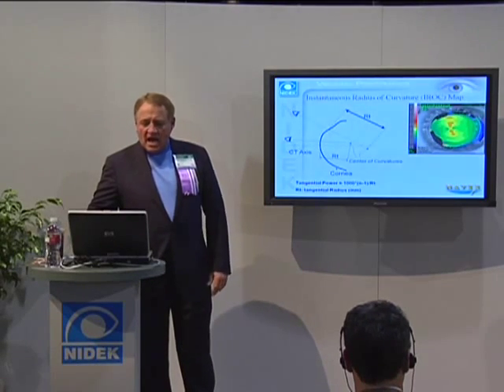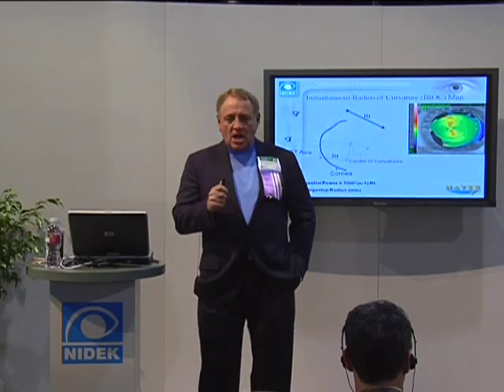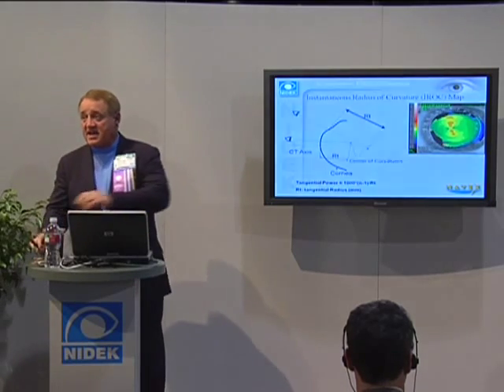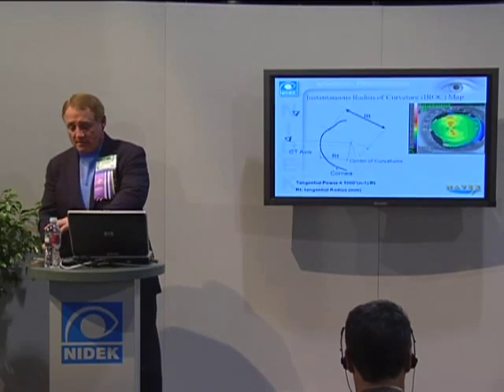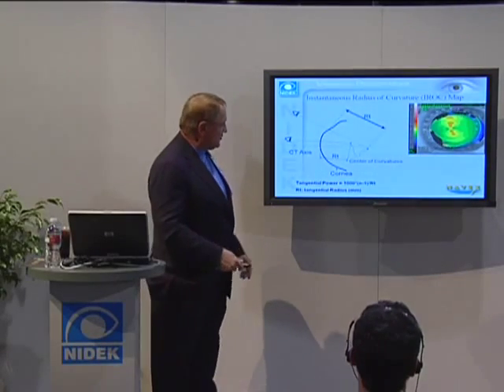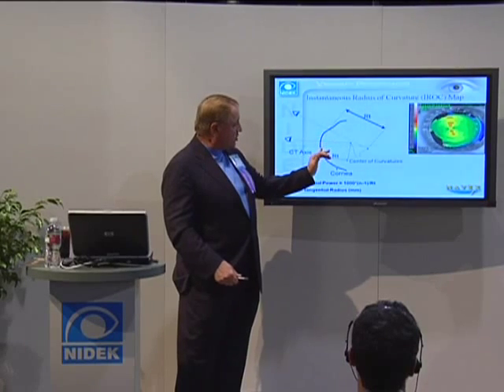Now, an instantaneous radius of curvature map, or a local radius of curvature, or what we've referred to in the past as a tangential map, is not relative to the center of the Earth. On this map, when we walk around here, that curvature is here.